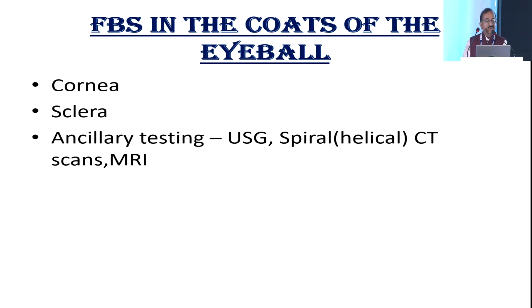Coming to the foreign bodies in the coats of the eyeball, this has been discussed exhaustively and extensively. Those in the cornea have been discussed by Dr. Aniket. We will be discussing those in the sclera. Apart from clinical examination, which has been adequately emphasized, ancillary testing in the form of ultrasonography, and particularly a spiral or helical CT scan in the case of suspected metallic foreign bodies, and MRI where wooden, glass or plastic foreign bodies are suspected, do come into the picture.